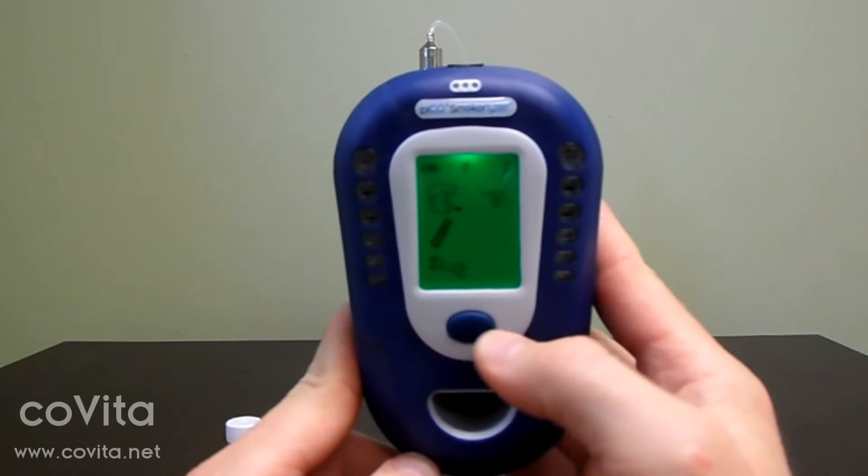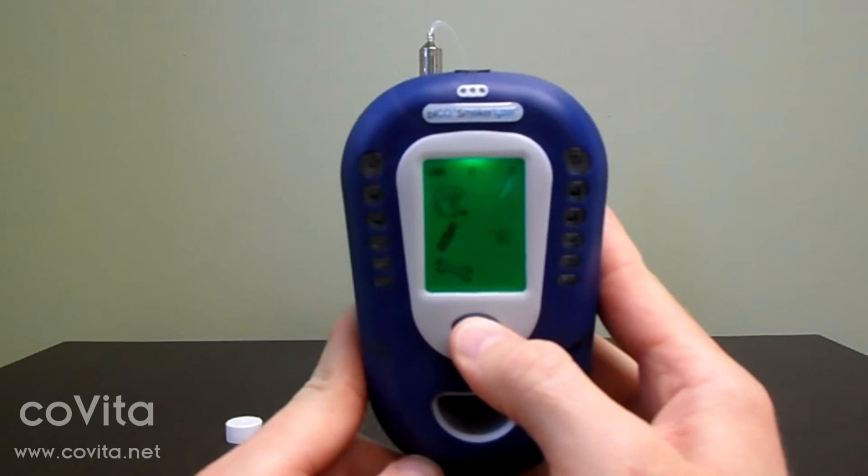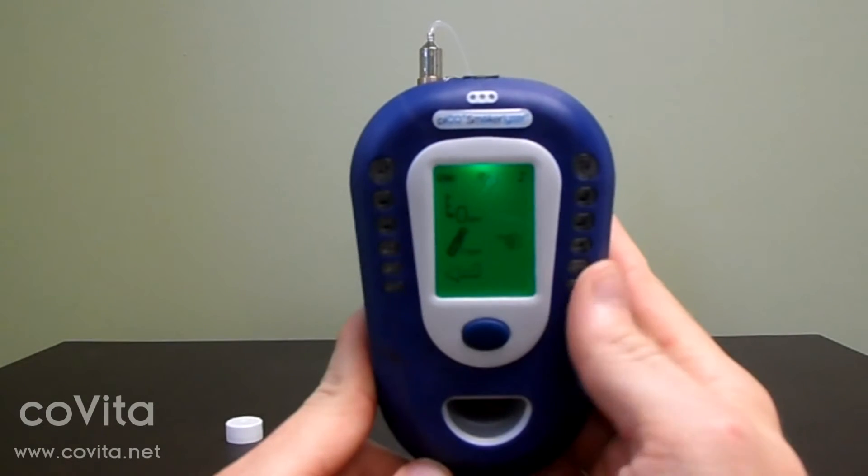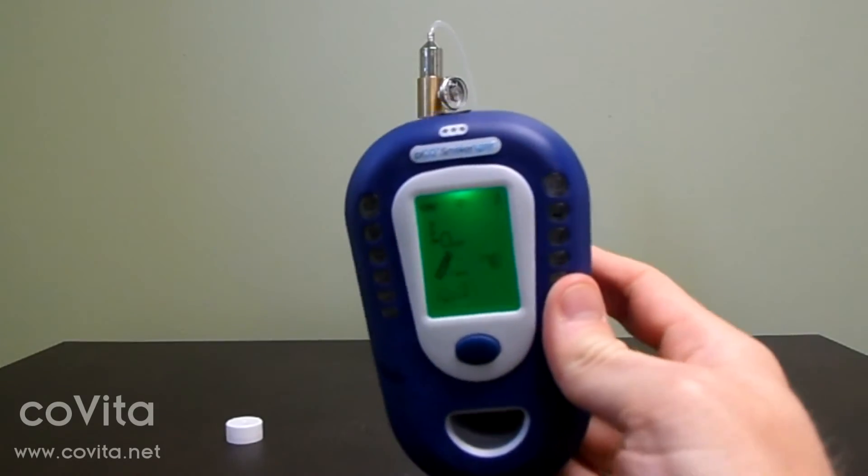Once on the home screen, single-click the scroll down to the can of gas. Double-click to select the can of gas. Connect the D piece to the monitor.